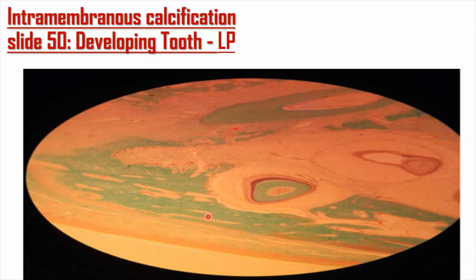The mesenchymal cells are going to differentiate into osteoblasts and osteoclasts. And then the osteoblasts are going to start forming bone tissue that is called osteoid. As you can see, this is the mesenchymal tissue, and in the middle here there is bone tissue that is forming. This matrix of bone that is deposited here is called the osteoid. Osteoid would then have calcium deposited to form bone tissue.